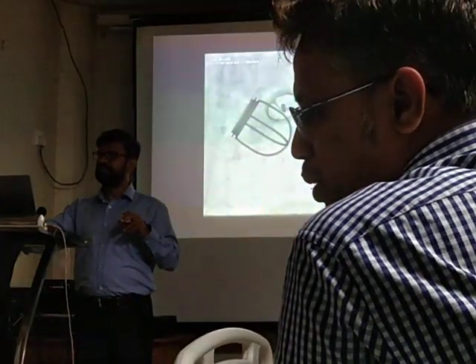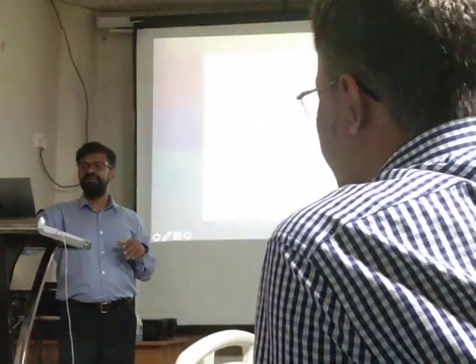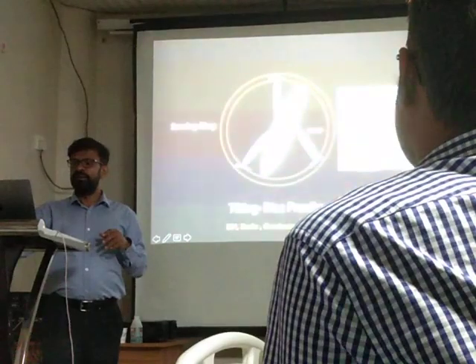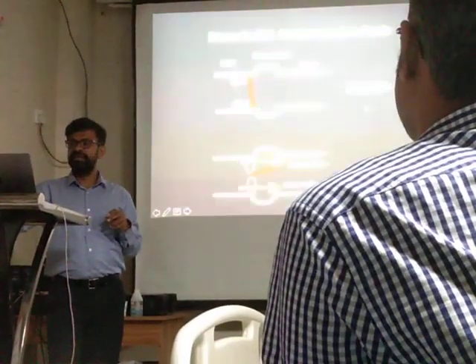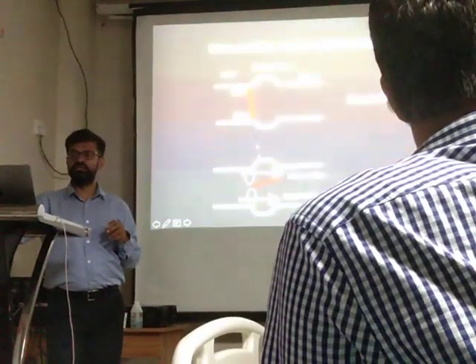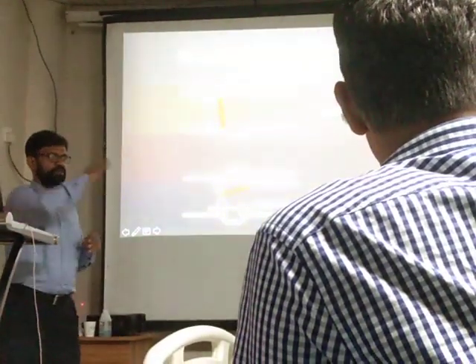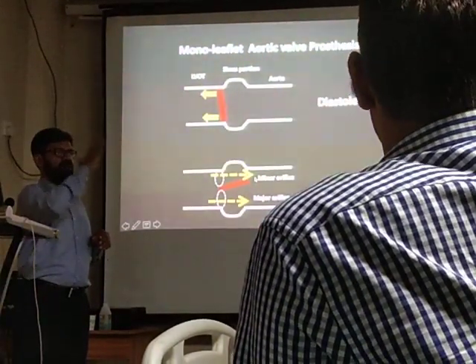So these are the gradients and these are the valves. This is the mitral valve position. This is the aortic valve position. This is the single leaflet. It looks like this. Remember, it opens. This is closed. This is open. It opens up to almost 80 degrees, 75 to 80 degrees open.